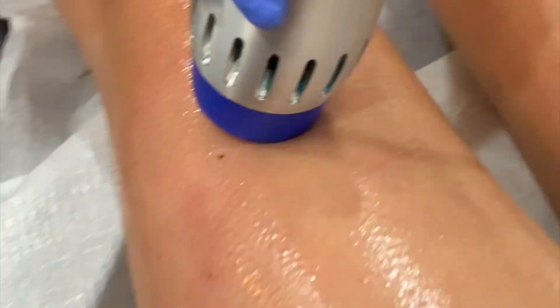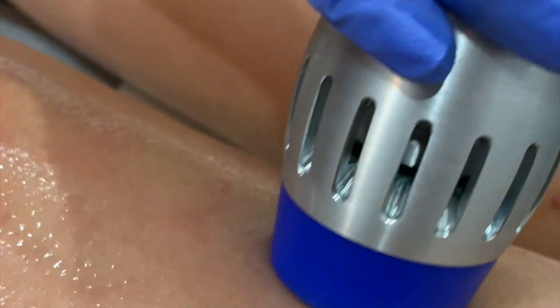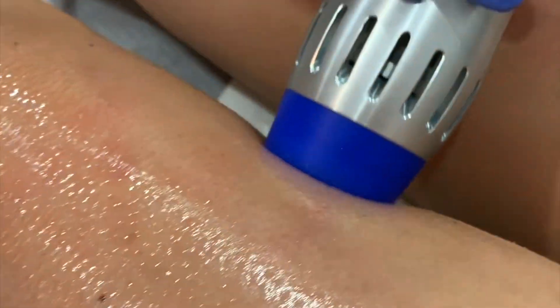Now I am using the Zimmer Z-Wave to help distribute the Sculptra more evenly in the subcutaneous plane. This is painless as well.